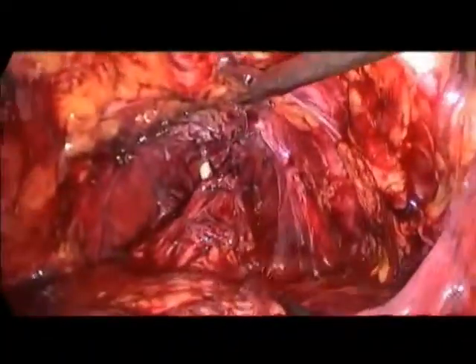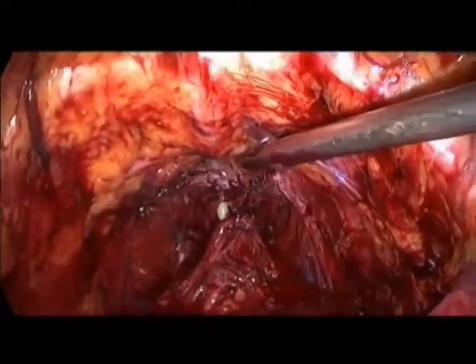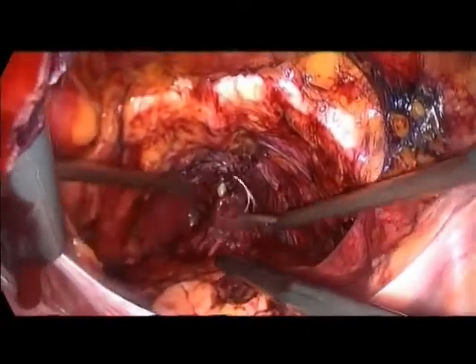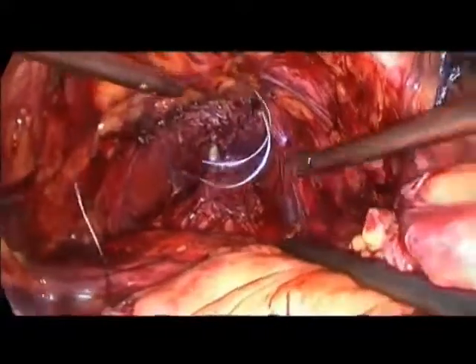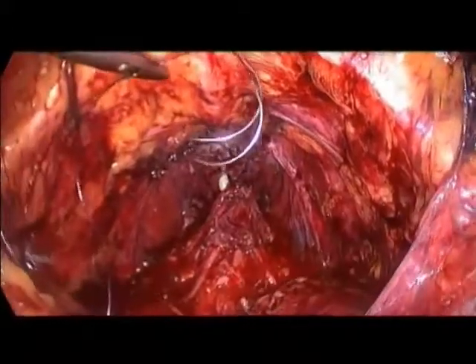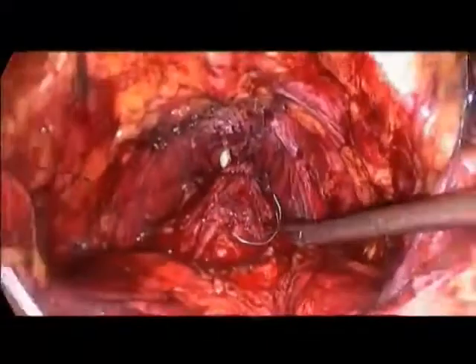In this case, for example, yes, without waiting for results. Do you have to wait for the results of the frozen section before starting the suture or not? No, I wouldn't. I'm quite confident with the way we were dealing with the bundles.